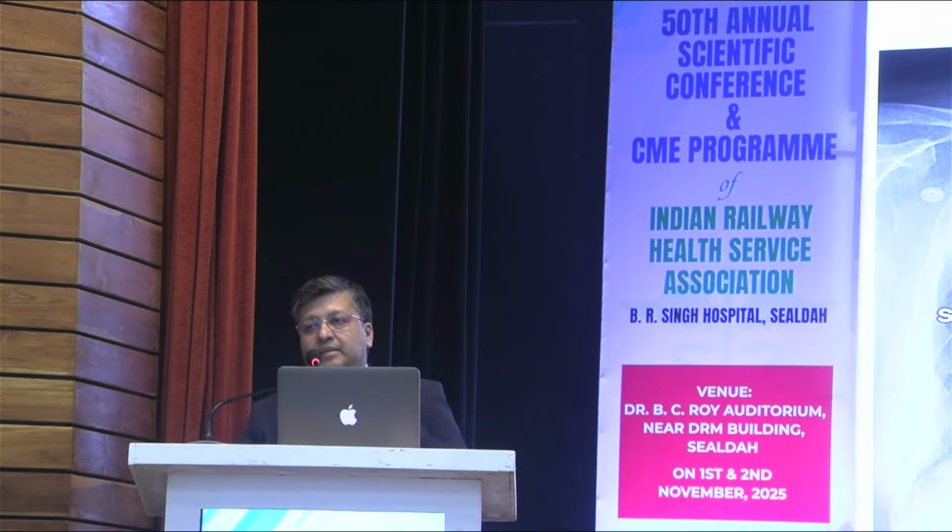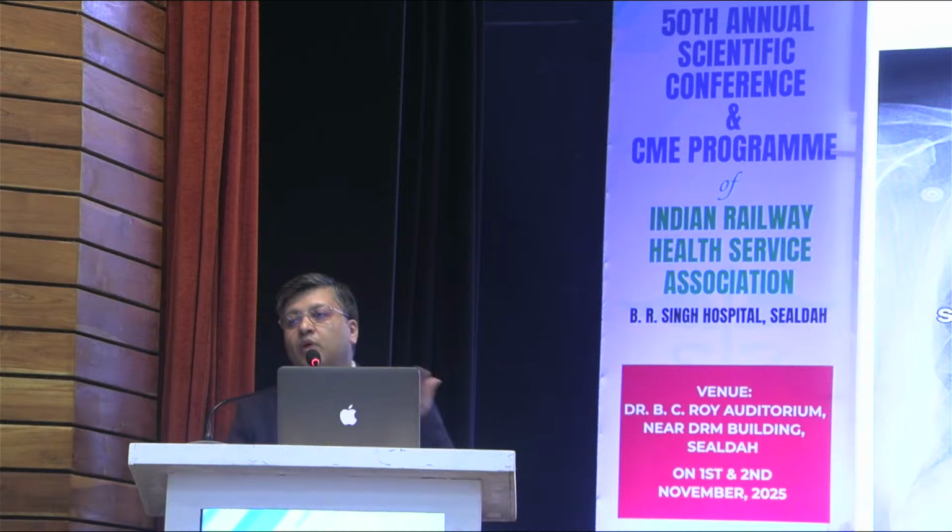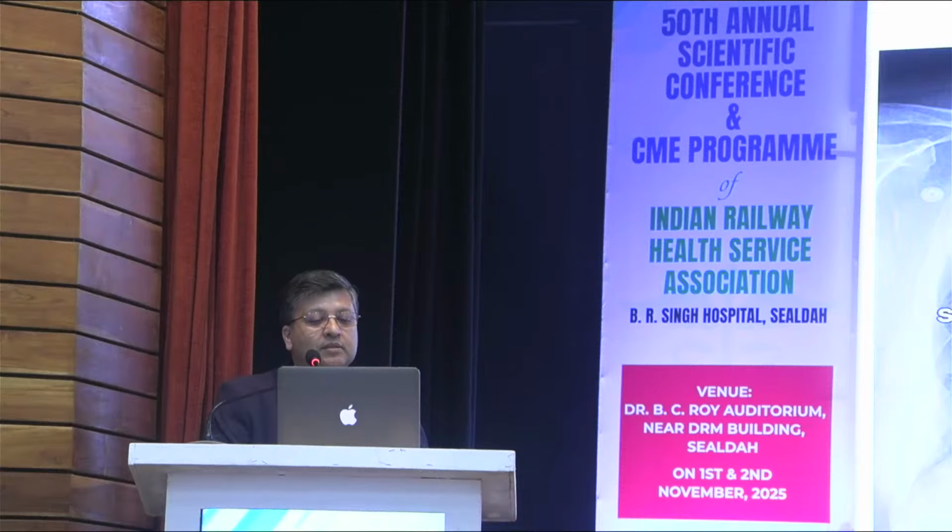So this is the previous generation ICD, when 2 coils were used. You can see this is like a pacemaker, a little bit bigger device. Now Abbott has come up with the Gallant device. It is a Bluetooth-enabled device, and you can see it is like a pacemaker lead, but there is some coil. These coils are actually for shock delivery.